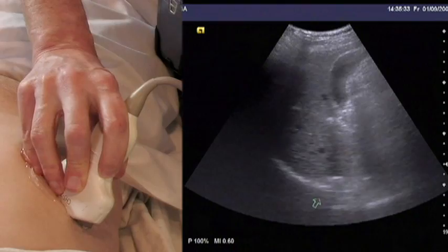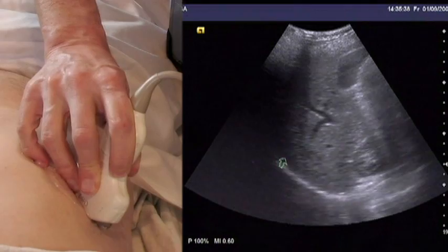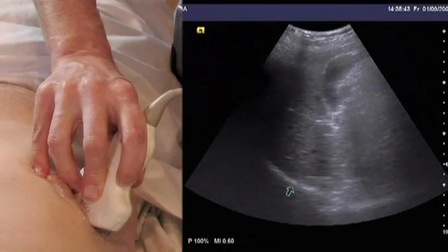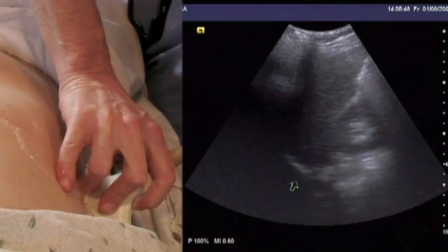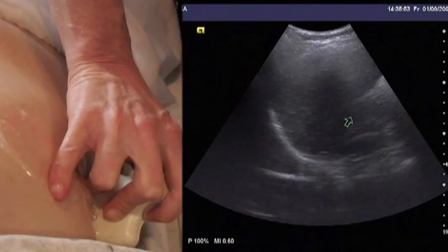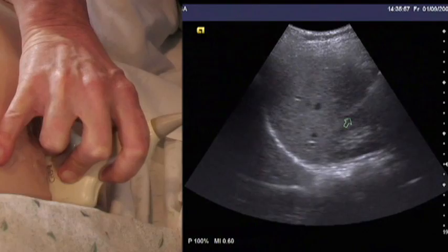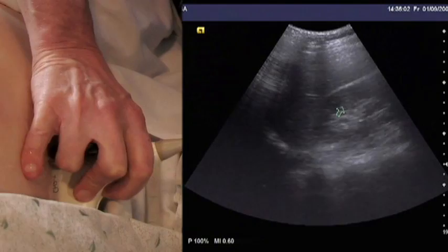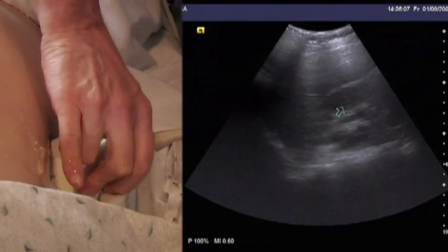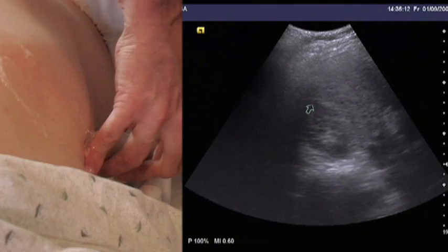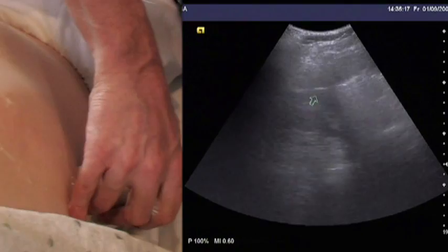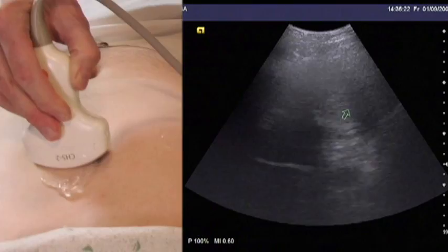No free fluid seen here. Scanning through all tissue planes, we check below the diaphragm. Then moving down to focus on Morrison's pouch, the interface between the liver and the kidney, scanning all the way through — the kidney disappears medially — staying off rib spaces and scanning all the way to the back. If there's any question, a transverse scan along the kidney confirms there's no free fluid anywhere around it. This concludes the right upper quadrant exam.